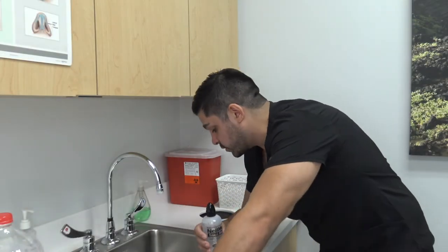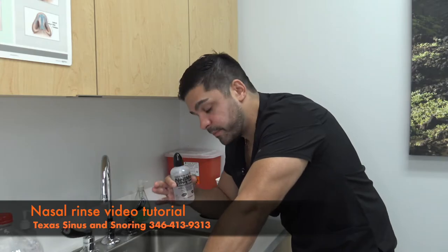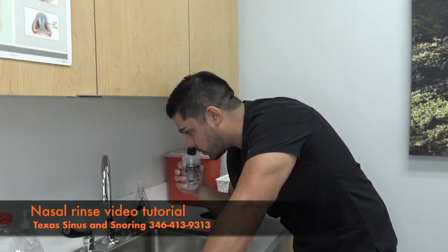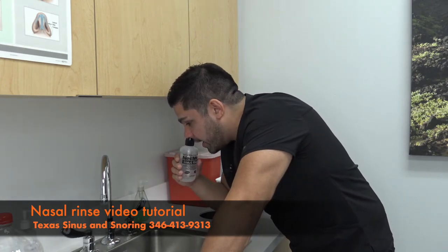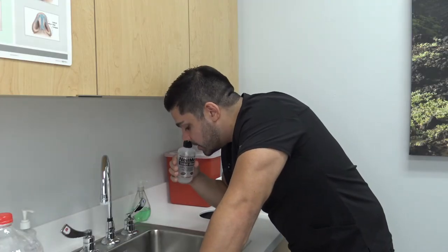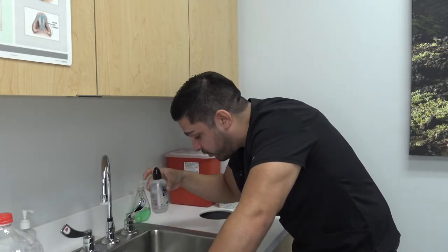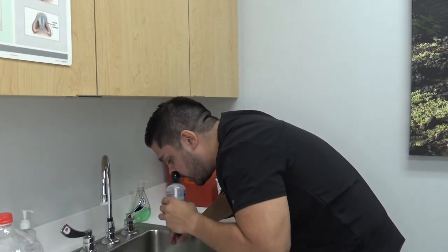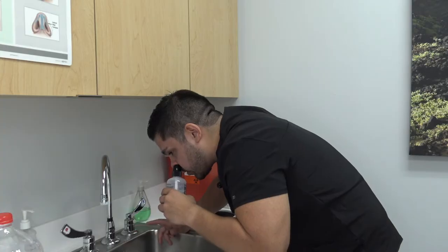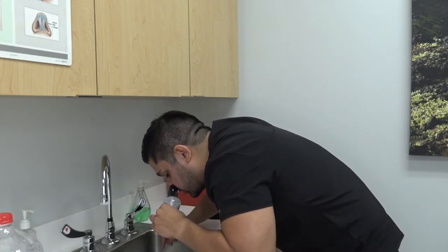As you practice, you'll get better at it. Lean over the sink with your head neutral, place the orifice into one nostril, take a deep breath in, and as you squeeze, breathe out through your nose — not your mouth. Once you've used about half the bottle, switch to the other side and do the same: breathe in, squeeze, and breathe out through your nose.